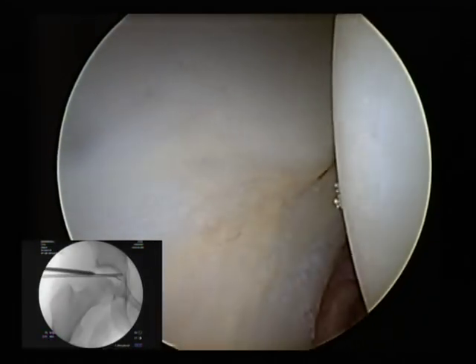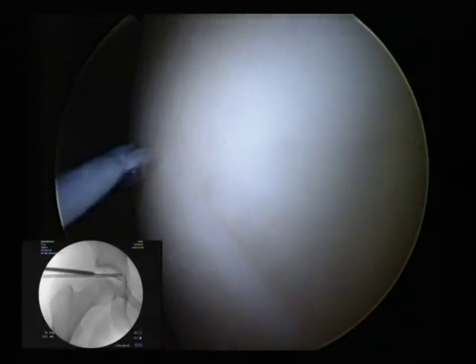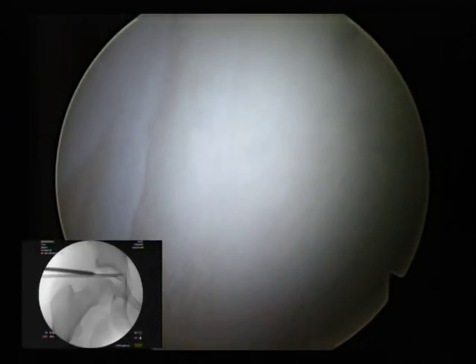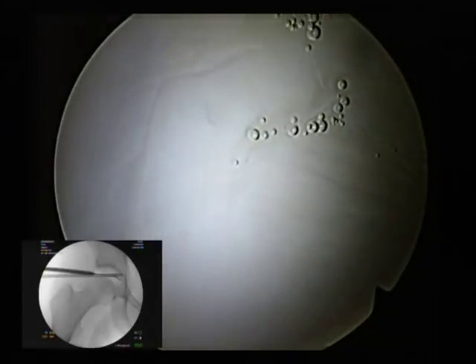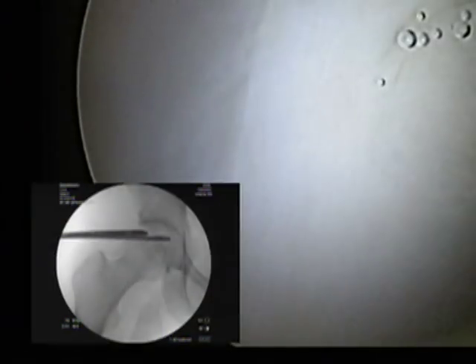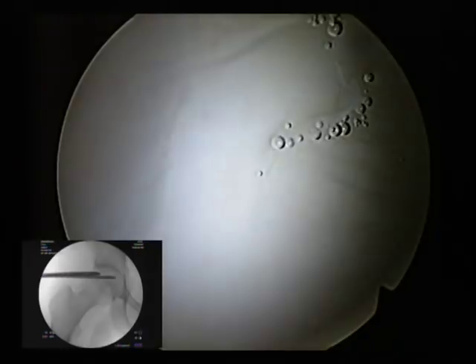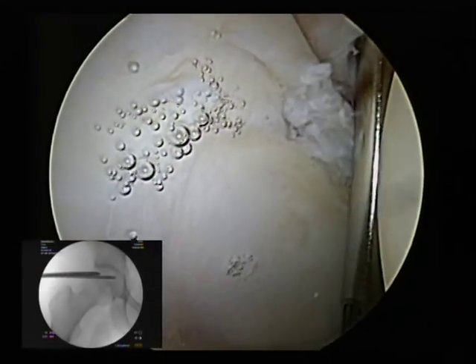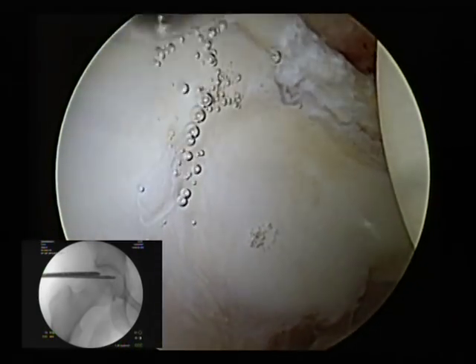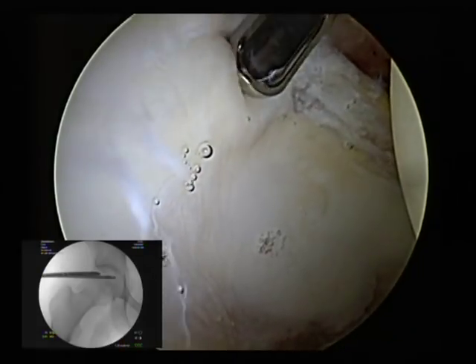Starting with the posterior labrum — that's a perfectly normal posterior labrum, normal femoral articular head. As we come around the lateral acetabulum, this is the lateral corner here. We can see on the video, the fluoroscopic images tell us where we are. Right at the corner there, there's a start of some degeneration. If we probe this tissue, there's a little bit of articular chondral delamination here.